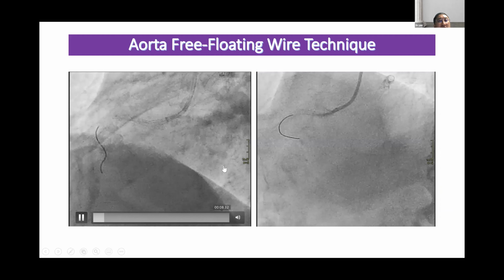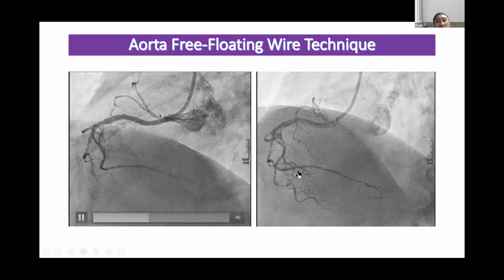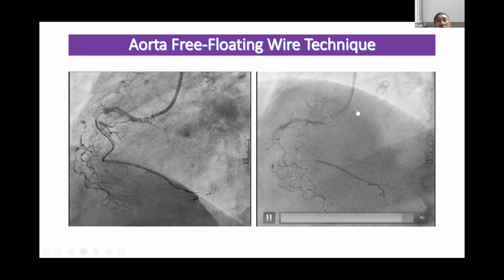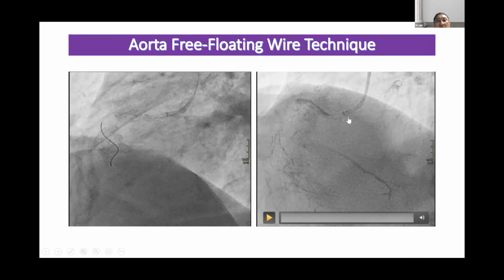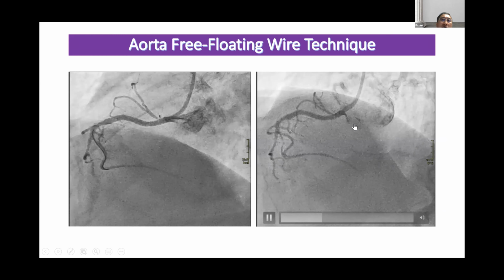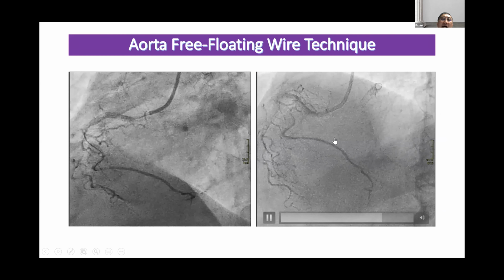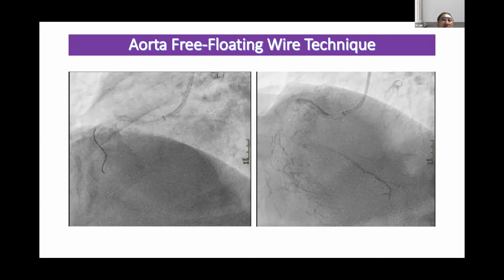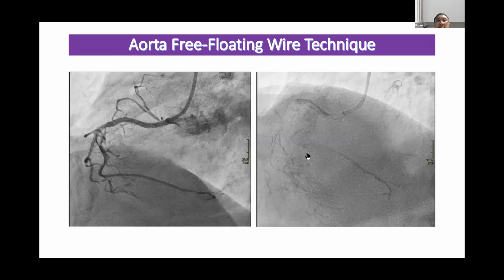So this is after stent implantation. If contrast is not an issue, we can always leave the guide wire in the aorta and then take a proper shot. That will also minimize the likelihood of the guide catheter disrupting and causing damage to the proximal portion of the stent.